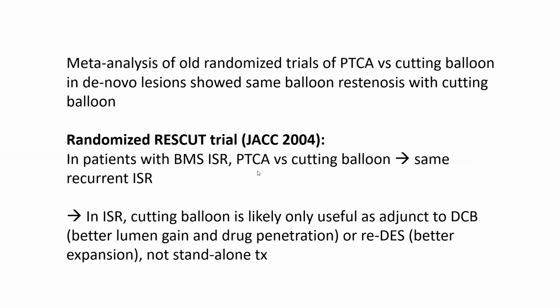Now, keep in mind a very important idea. Even though you get more lumen gain with cutting balloon versus standard balloon, and you get better acute immediate result, old studies of angioplasty versus cutting balloon in de novo lesions from the 90s have shown that restenosis was the same. So cutting balloon by itself as a standalone treatment doesn't have much value. It has value as a preparation, improving lumen gain, as a preparation to something else.